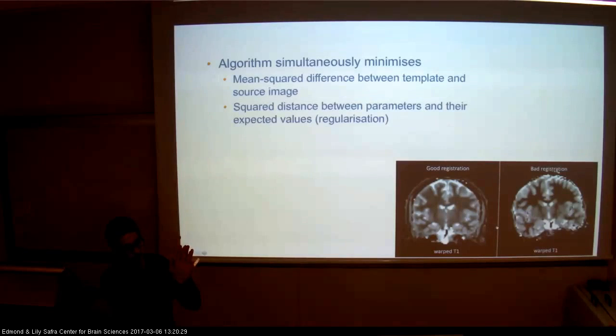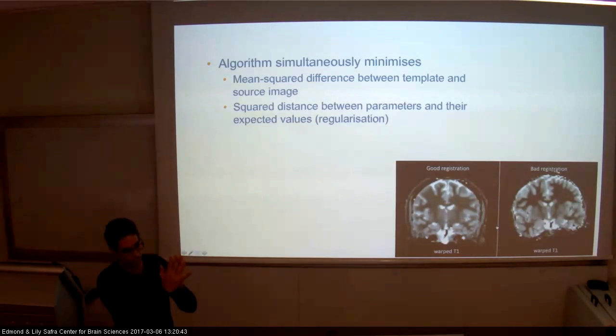That was rigid body. But let's say the k-space measurement was different and there was some stretching. Maybe I will also allow stretch, things like that. Maybe it's a totally different way. I really need to do warping. I need to mush the images to get them to be together. More parameters.